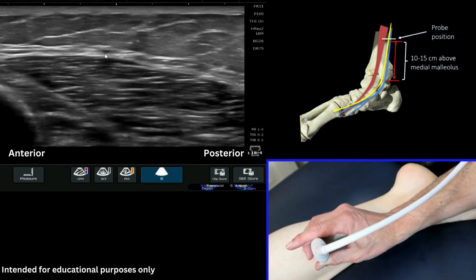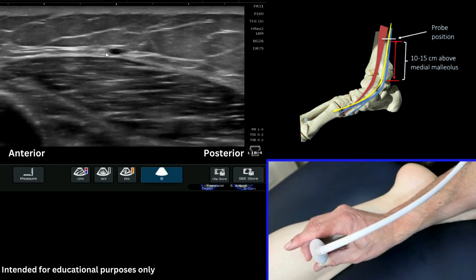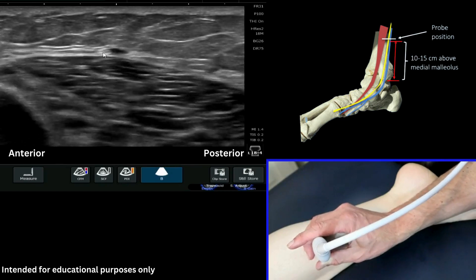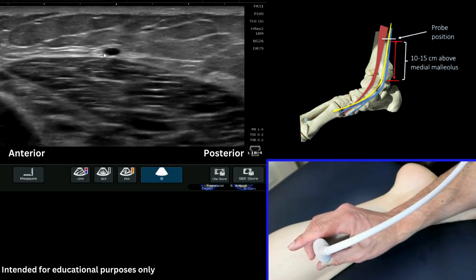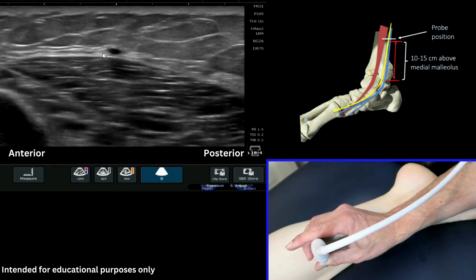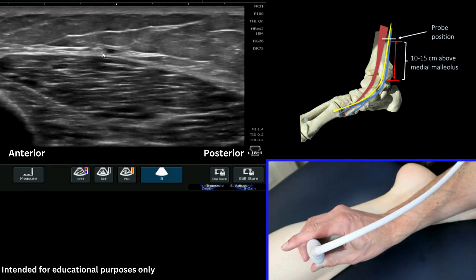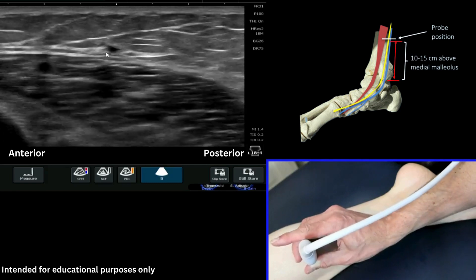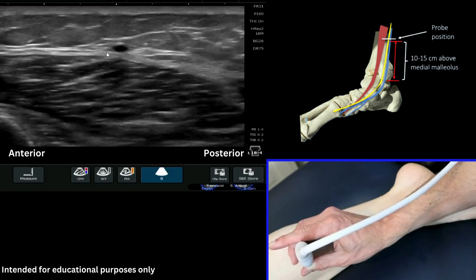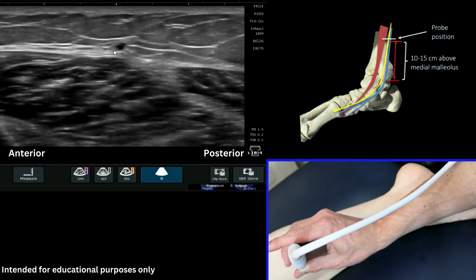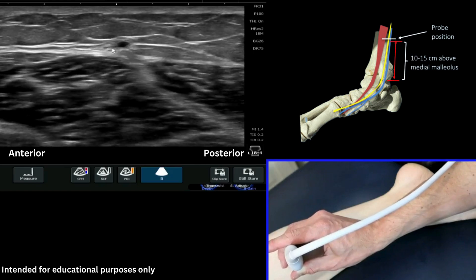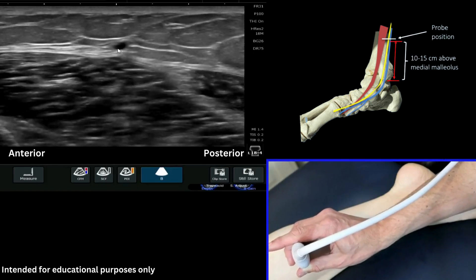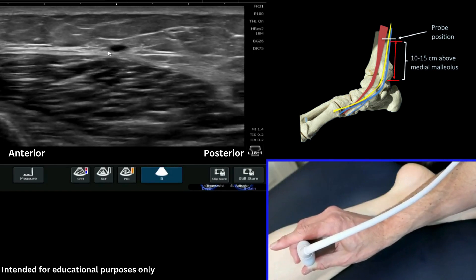It sits on the anterior aspect — the more anterior aspect — of that vein usually, but it does vary from person to person. You can see as we come up the leg, keeping our pressure light, that that structure remains constant adjacent to the saphenous vein.